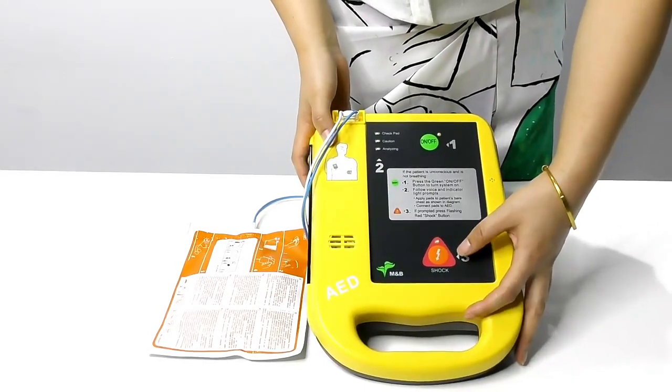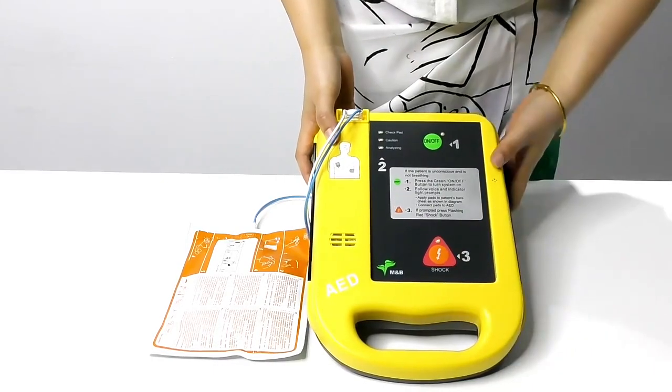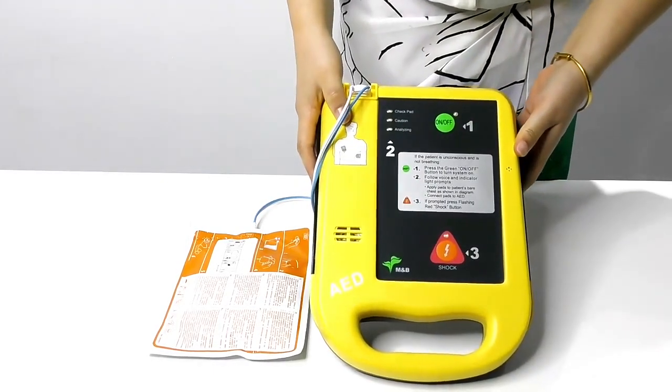If shock is needed, we press the shock button to continue. It's safe and easy to operate.